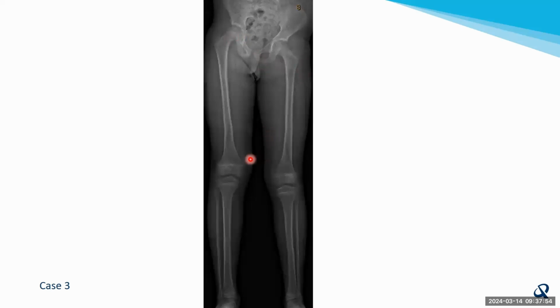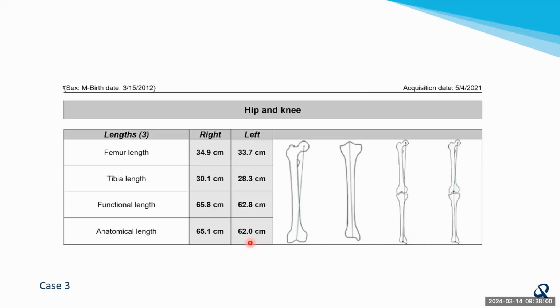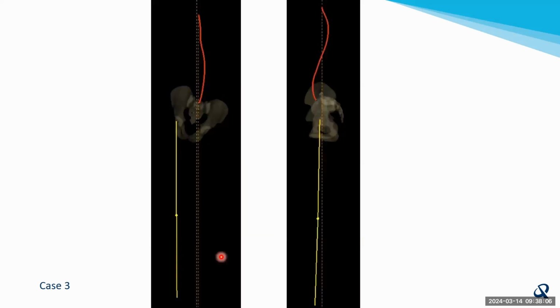And if we look at the lower limbs, it becomes pretty clear that the right lower limb is much longer than the left. And if we do the measurements, we can see there's just over a 3 centimeter anatomic leg length discrepancy. But what's kind of cool about the kids when we're talking about coronal and sagittal balance is they can have this 3 centimeter leg length discrepancy. Their pelvis can be rotated around to almost 3 o'clock, but they maintain their sagittal balance, or people try and maintain their sagittal balance, and kids are great at it because they're so bendy.